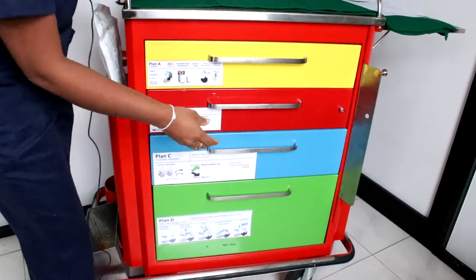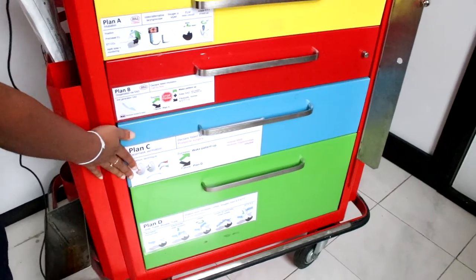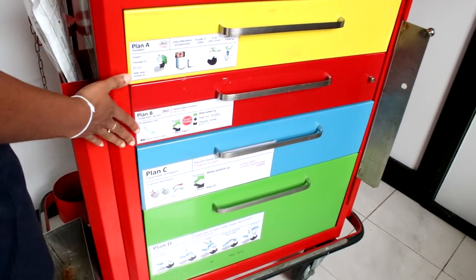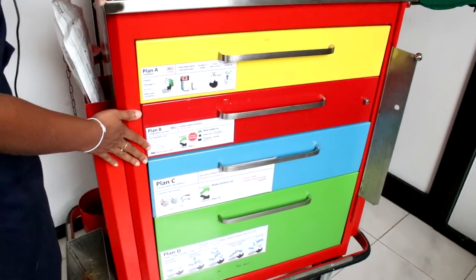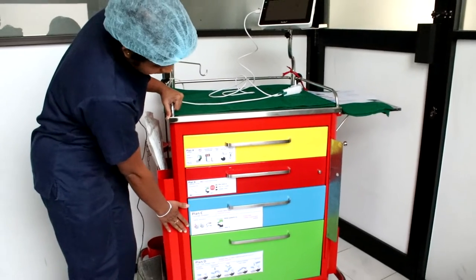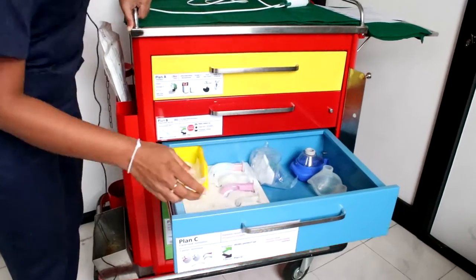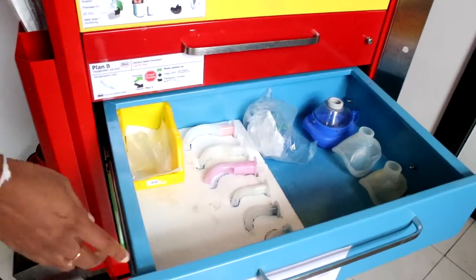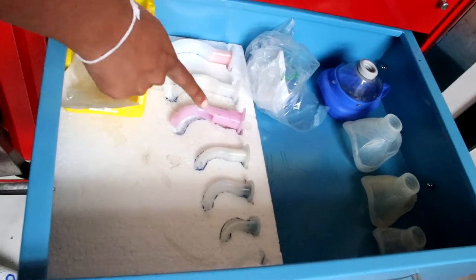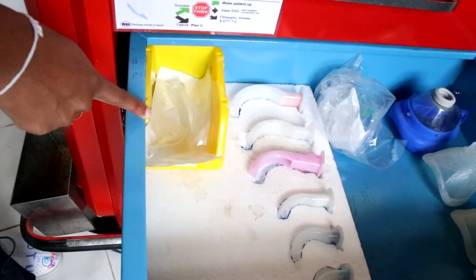Let's move on to drawer C. This is where you have found it difficult to intubate and ventilate with the supraglottic airway devices, and now you are trying to somehow oxygenate the patient. For that you are going to do bag mask ventilation. So you will have different sizes of masks, different sizes of oropharyngeal airways and nasopharyngeal airways.